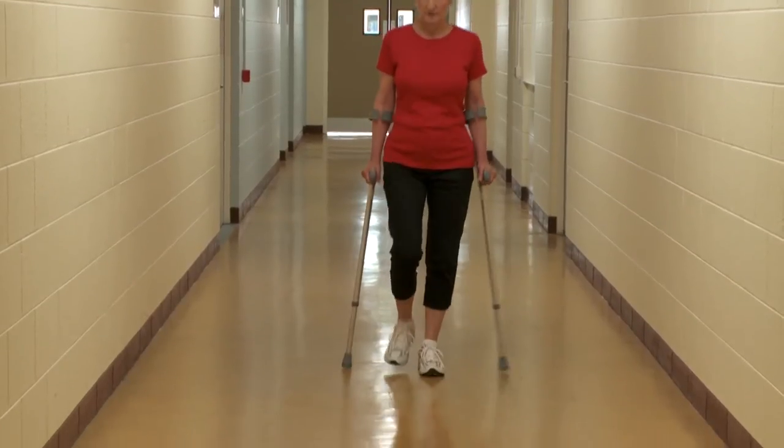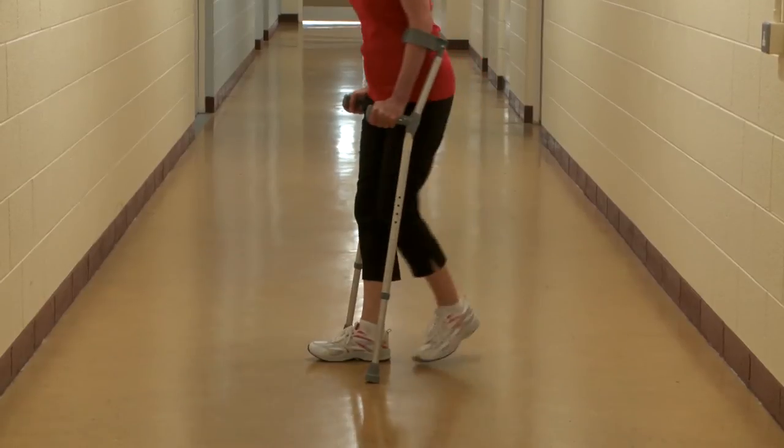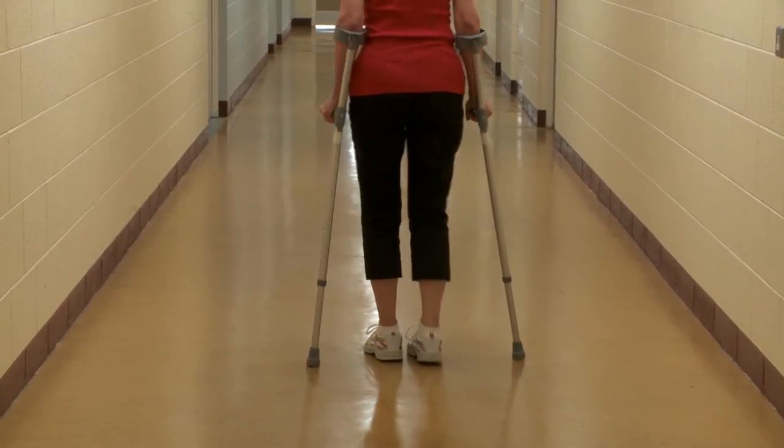Step your other foot past the crutches. Repeat this with each step. If you need to turn, make a wide circle. Avoid twisting on your feet.